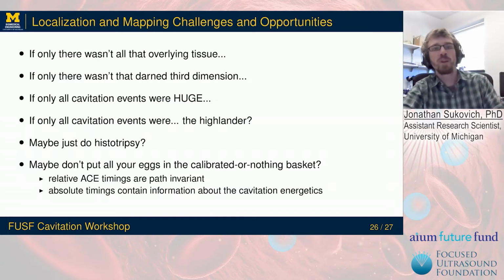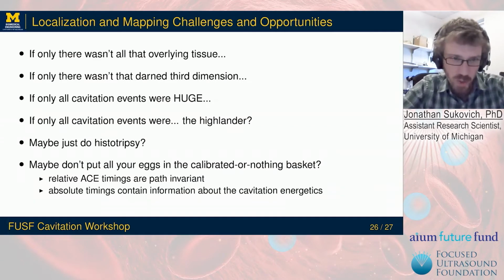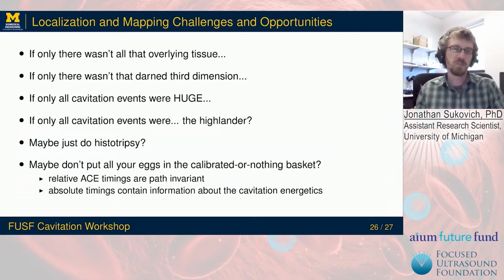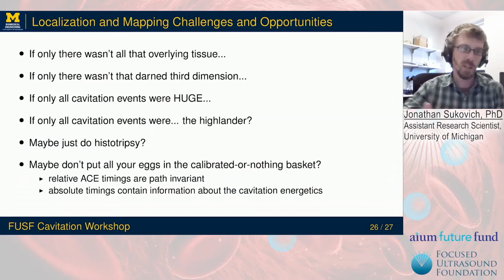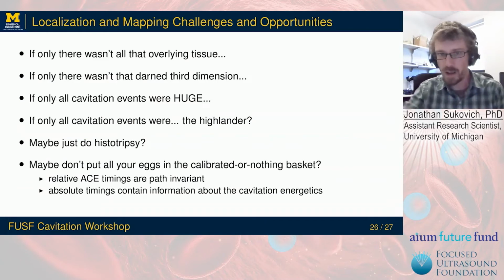And it's come up whether we need calibrated measurements or not. I don't know that we do. The relative timings of those ACE signals are path invariant, and it's going to be the same on every single array element between the nucleation and collapse. And that absolute timing contains information about the cavitation energetics, which you can then use to inform on biological outcomes. So worth thinking about.